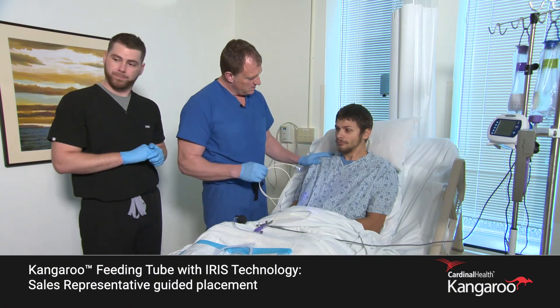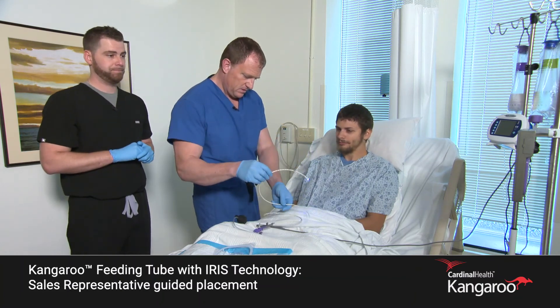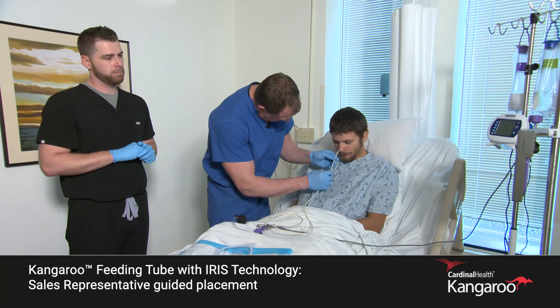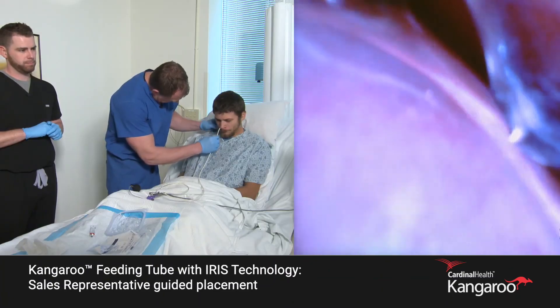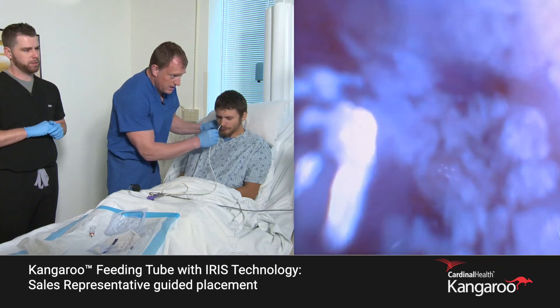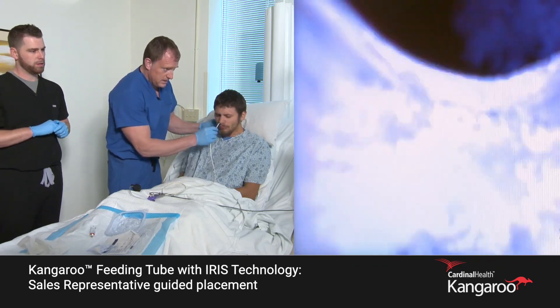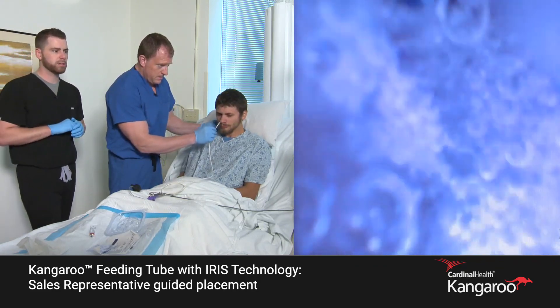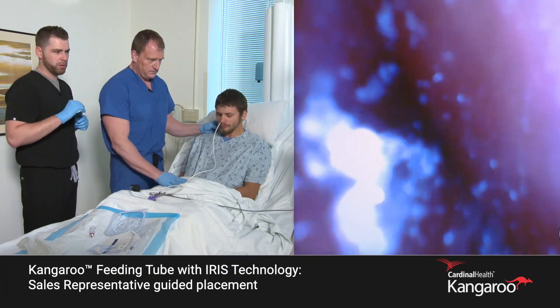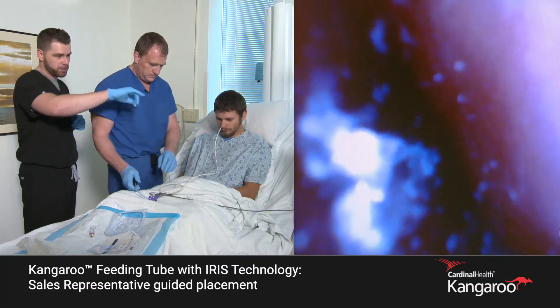Alright, chin to your chest. It's going to pass and I'll ask you to swallow in just a moment. Swallow right now — great. Let's hold right there. So what we're looking at on the screen: we see the collapsed nature of the tissue.